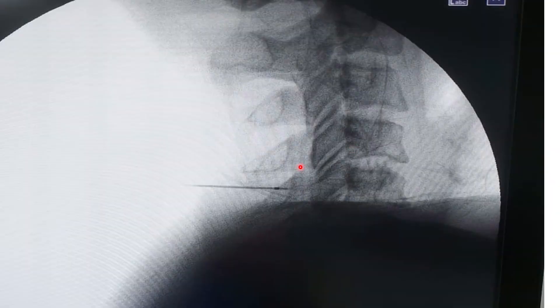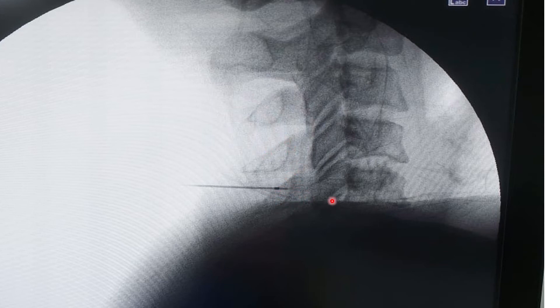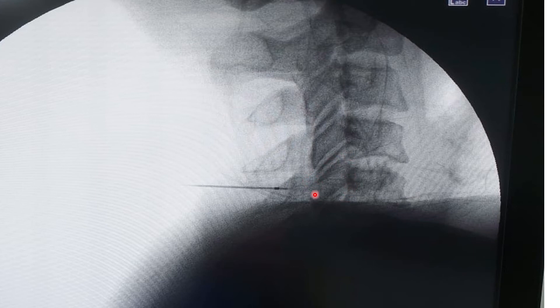Once we hit the bone, go for the lateral view. In the lateral view, my needle tip is nearly at the spinolaminar junction, whereas it should be at the articular process. So I can go maybe a centimeter inside. One important thing: it needs to be a true lateral view — meaning both articular processes should coincide with each other.